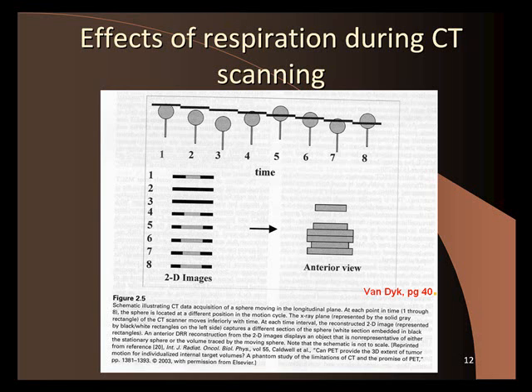But the problem with that is that you're hitting a lot of things you don't want to hit. I mean, you're hitting the cord, esophagus. There's nerves in there. There's all kinds of things. Liver, it could be down to the kidneys and liver level. There's all kinds of things you don't want to hit. So over time, we want to shrink those margins. Well, how do we shrink those margins? Well, we can shrink those margins if we know where the tumor is in time.